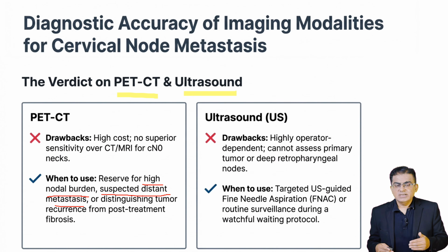What about ultrasound? Ultrasound is highly operator dependent and it completely fails to assess the primary tumor or deep retropharyngeal nodes. We reserve ultrasound strictly for targeted ultrasound guided FNAC or for routine surveillance if we are putting the patient on a watchful waiting protocol.